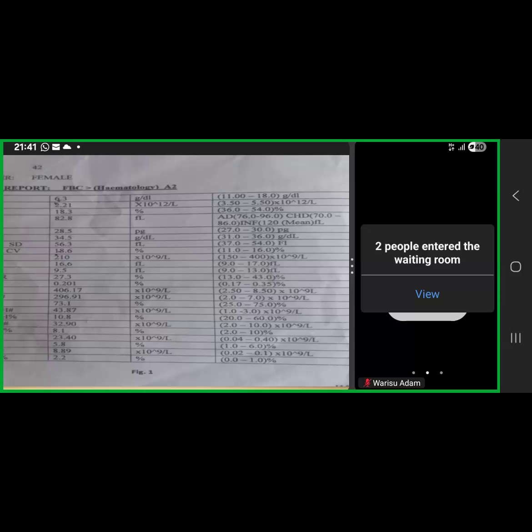And it is why hemoglobin is low, because red cells are being crowded out. They are not able to come up because the white cells are too many. If you see a marrow like that, you see it's crowded with white cells. So red cells don't get the chance to develop, hence the low hemoglobin.